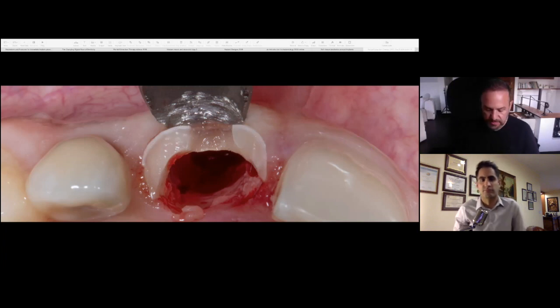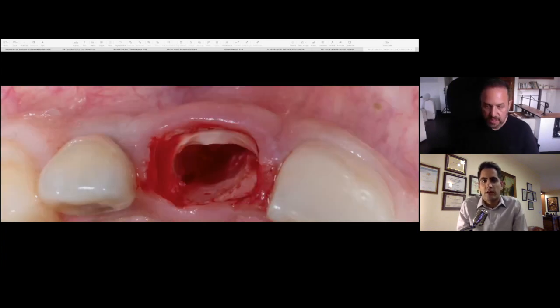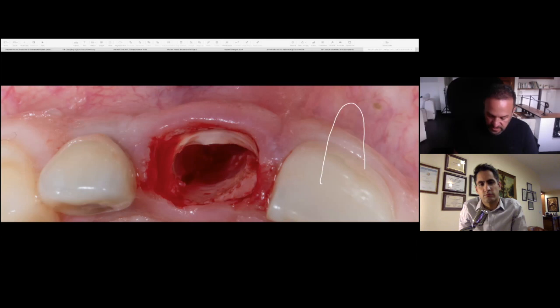It's very important. Once we've done that, the next thing we are going to do is create the chamfer with the same round drill. So what we've done here is, in the shield, if I just draw this and we create the shield, the shield is now at bone level. Now I'm going to create a 2 millimeter chamfer. The original article called for a bevel. Now the problem with a bevel is it doesn't give you enough space. You want a chamfer, and the chamfer should be 2 millimeters. That's very, very important. And that 2 millimeters then allows you the space.